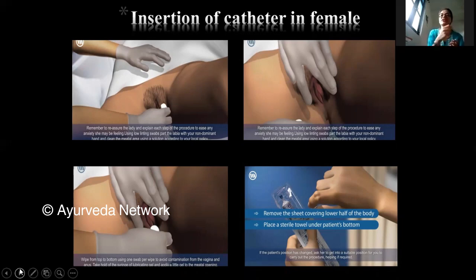You should remember, you have to clean from front to back, and after you use one wipe, you throw it and use another wipe, so that you don't introduce any infection. Our primary purpose of doing so many steps is just to minimize the amount of infection we provide to the patient. So you must ensure that the meatus is totally wiped out.